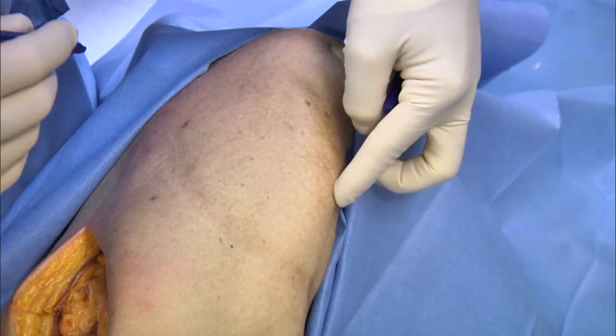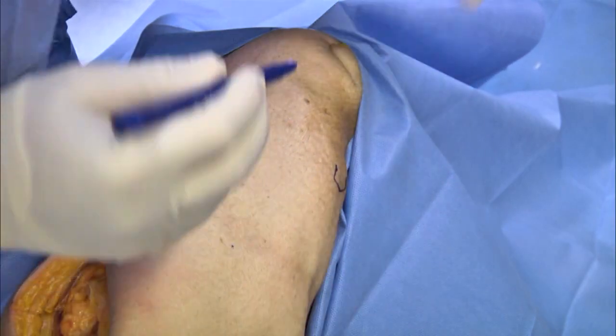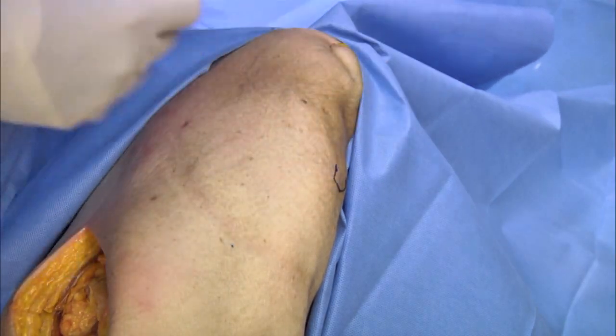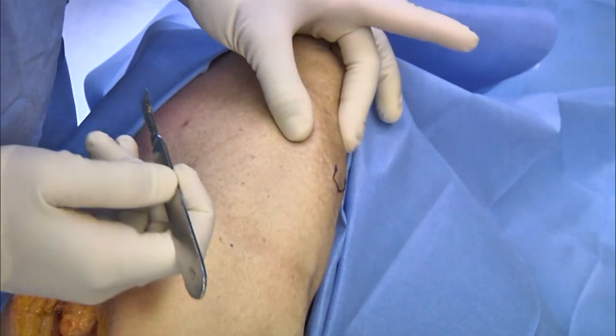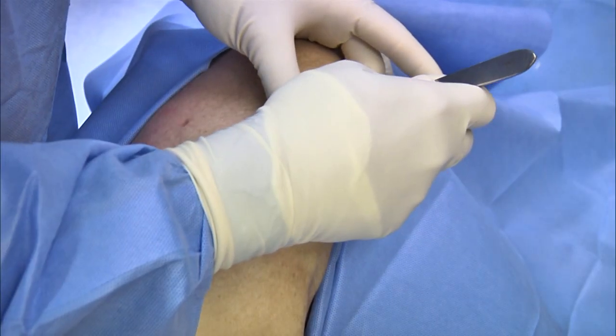So right now I'm going to palpate the ASIS and just mark that out as a reference. And then typically it's about 3 finger breadths up from that is where I center the array. I'll take a knife, make 3 stab incisions, and you can feel the inner and outer table of the pelvis. I just center myself right in between.